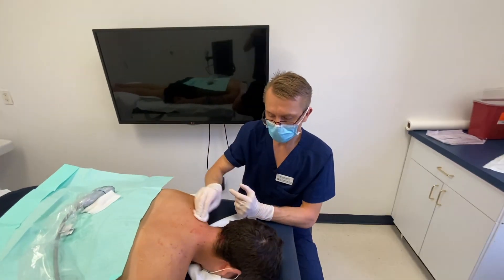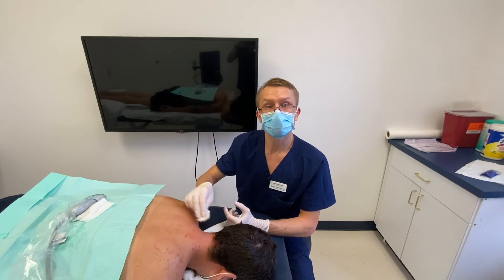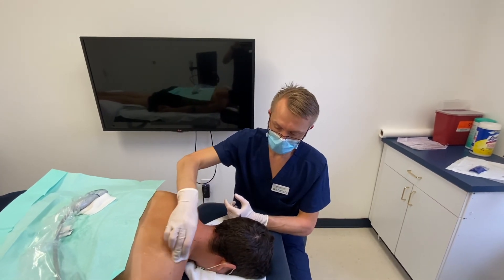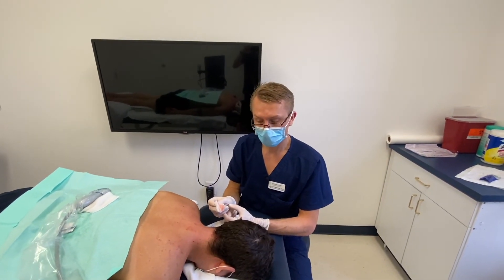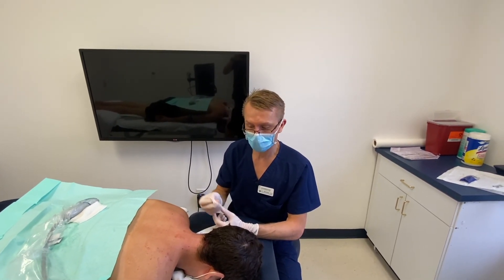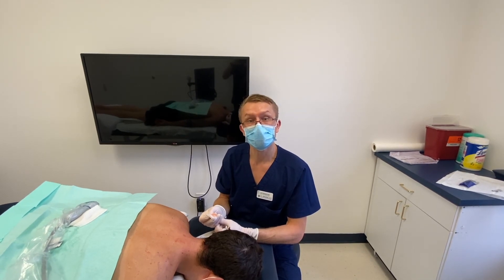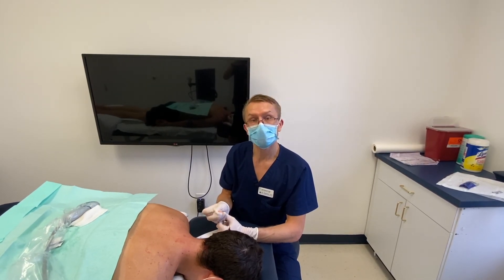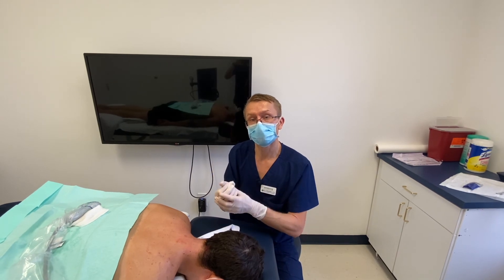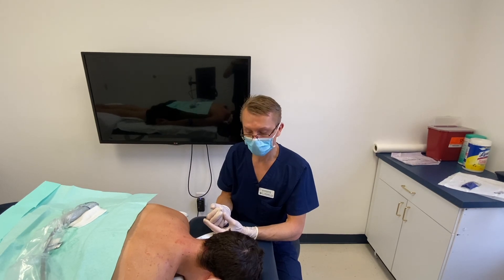Now we are done with the prolotherapy PRP of this patient's cervical spine. Next we're going to go ahead and clean him up, and then he's going to heal. We're going to get him under the laser to get the PRP nicely activated. For the next week or two, this patient is going to undergo healing, and the ligaments are going to get nice and tight and strong and provide him some stability. Hopefully he should get some pain relief pretty quickly.